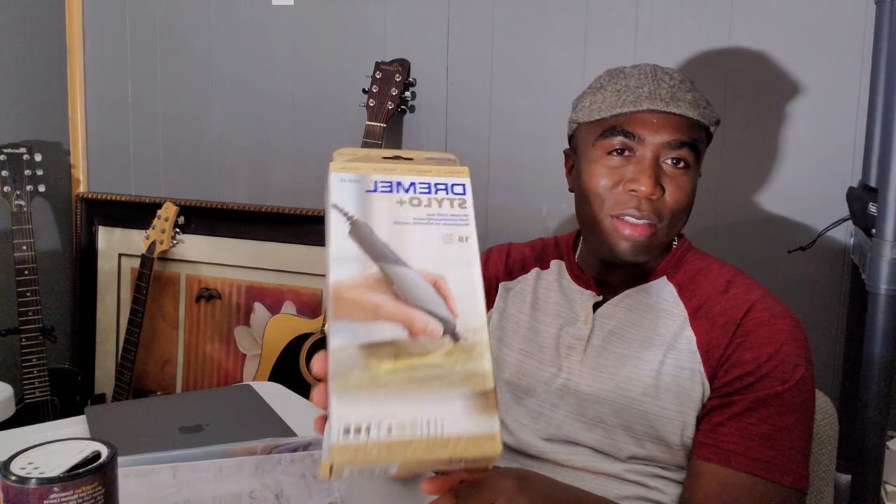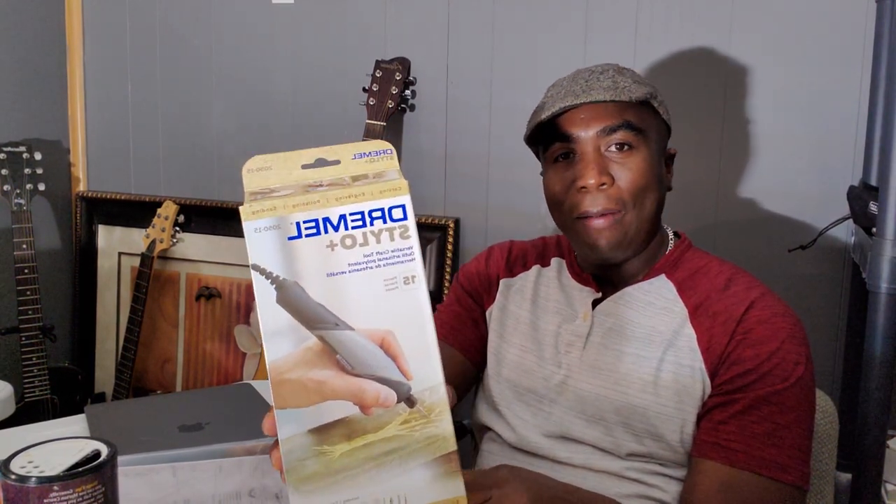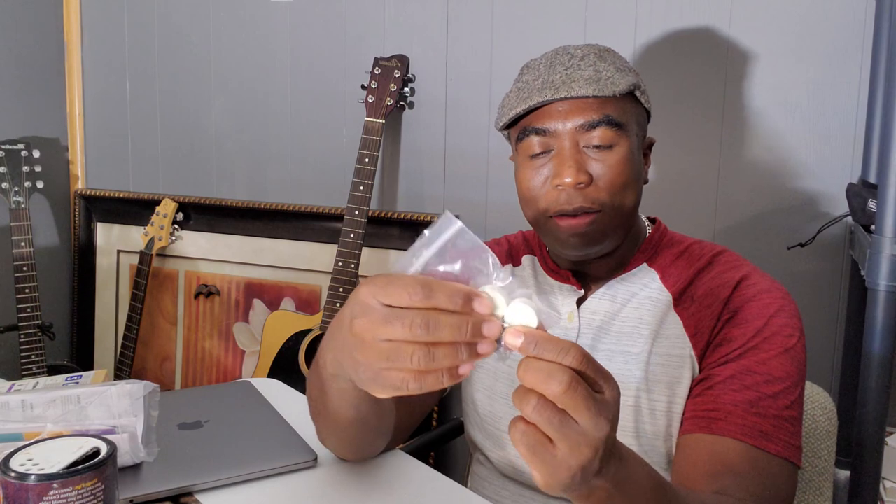First, you need a Dremel tool. You can get a Dremel tool anywhere — Menards, Home Depot, pretty much anywhere. This tool comes with instructions and comes with so many adjustment kits. This is the polishing wheel here that you can polish with. This is some type of sandpaper that you can use. And this is kind of a small, tiny bit over here. So it is simple.